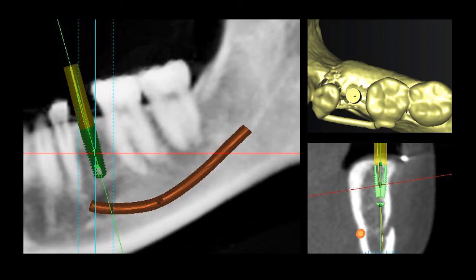On the lower hand view is a very important view. It is the cross-sectional view right in the center of where the implant is going to go. On the right-hand side is the buccal wall, while the lingual wall is on the left. We can appreciate the mental foramen exiting the buccal wall. We can determine here in this position that I had used to place the implant, the implant is placed too buccally. It's very close to where the buccal bone is.